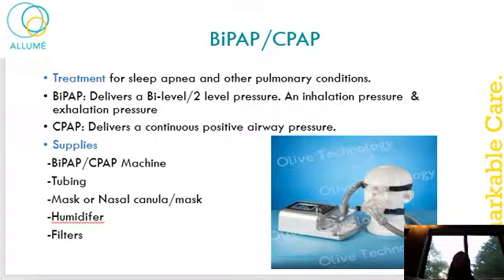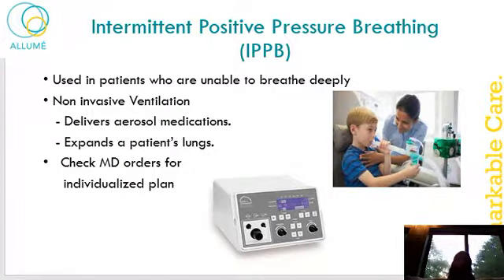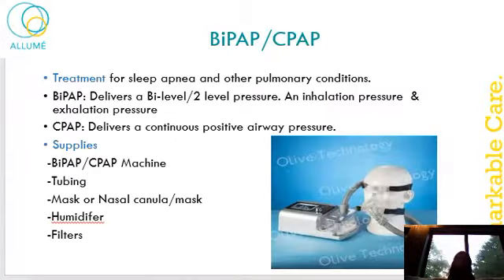So in order to deliver this type of treatment to your patients, you'll need to have all your supplies: the BiPAP or the CPAP machine, tubing, mask or nasal cannula mask, humidifier, and most likely some filters. I just want to go back to that slide again.